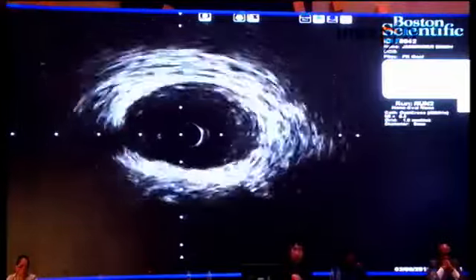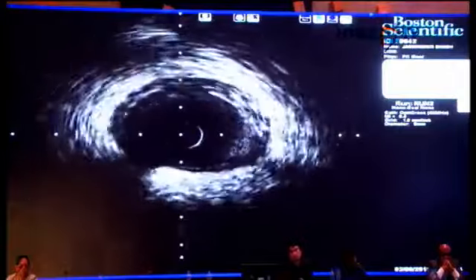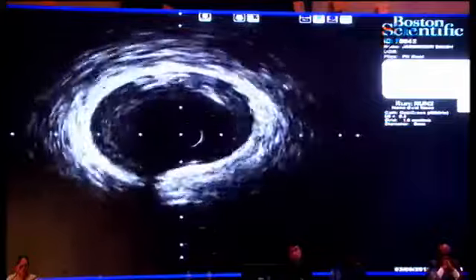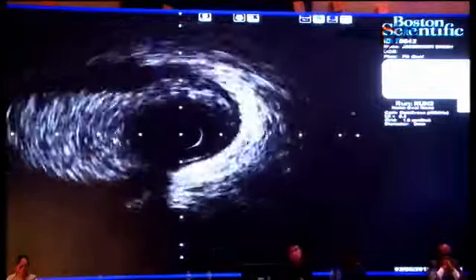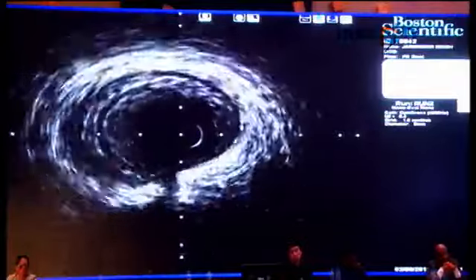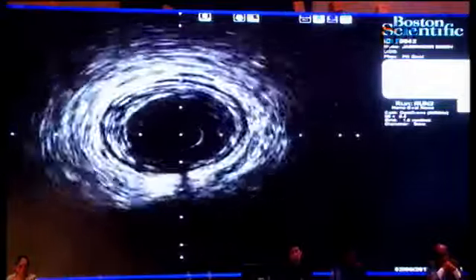Now it's the side branch. PL. Maybe it's the, no, PL comes here. Can we see fluoro where it is? Let's see. Yeah, that's the PL coming in. That's the PL side coming in. Completely healthy, and it is all within the lumen.